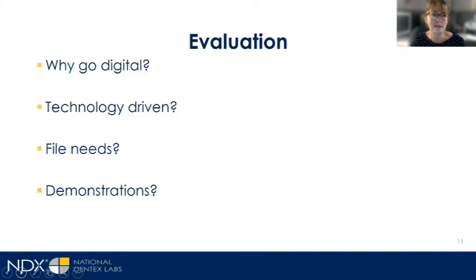So the new dentist, the very first thing they do at the new patient appointment is they took a digital scan, just a wellness scan, an introductory part of your new patient exam, part of your permanent records at the practice. And at the end of that appointment, the dentist came in and reviewed the scan with them. He said, can you see this tooth up here? It's pretty black. It has a large amalgam filling on it. And there is a crack right through the middle.